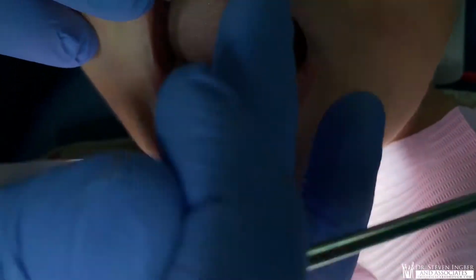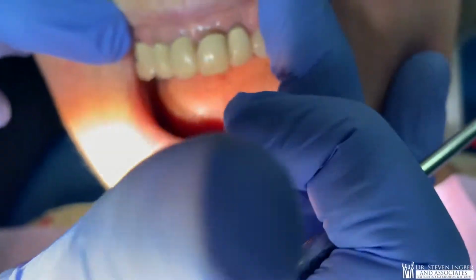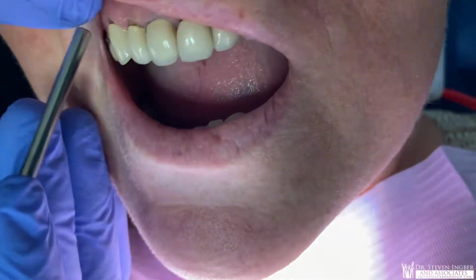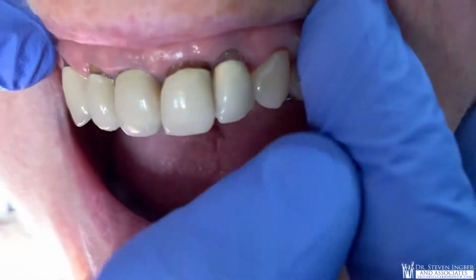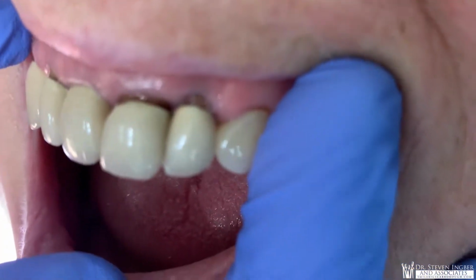Instead of it being an aged appearance, once again, this is inherited dentistry. I didn't do any of this work. It's actually done well. It's just old, and there's all the recession. Ring around the collar all over the place. Look at all the black lines. Isn't that unusual? Go to the other side. Right here. Go tight. It's good.